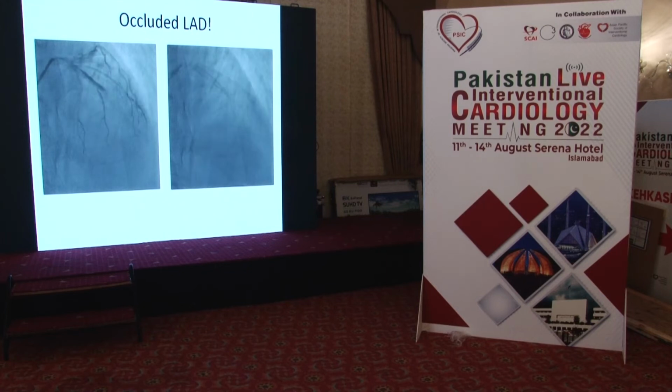Yeah, it could be that I haven't covered the edge dissection appropriately. Could be, yeah, it could be an intramural hematoma which is milked down. So there are a number of possibilities here. So how am I going to decide?